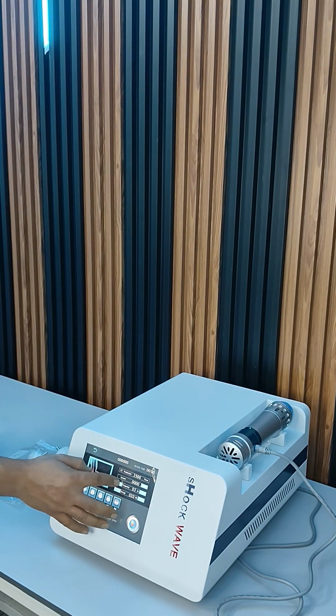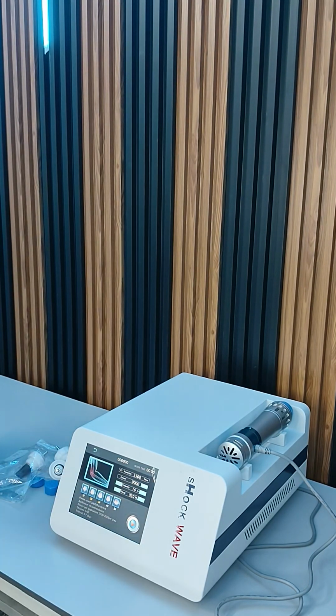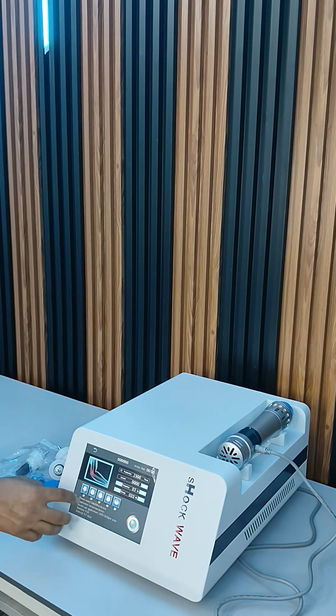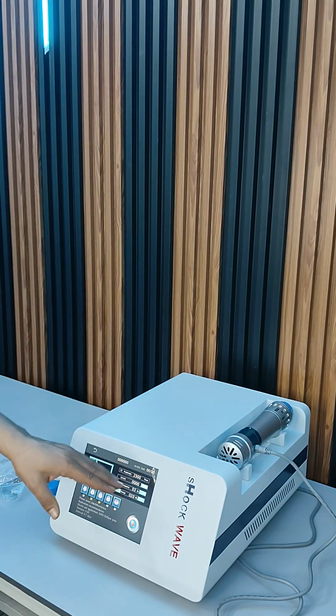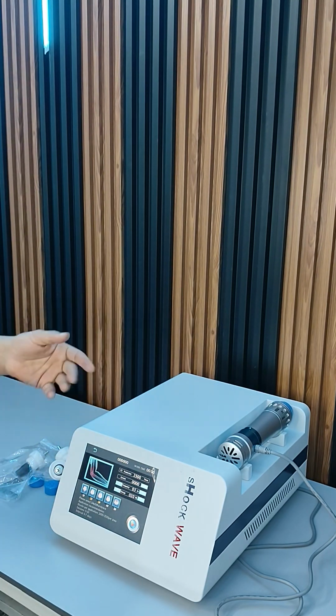You can vary the frequency from 1 Hz to 16 Hz, and you can vary the energy also from 5 millijoule to 200 millijoule. These are the recommendations. If I select the elbow, the handpiece recommendation is there, and these are the presets. The number of shots is recommended here, the frequency is 3, which is recommended, and the energy is 20 millijoule, which is recommended. You can use it as it is, or you can vary it.